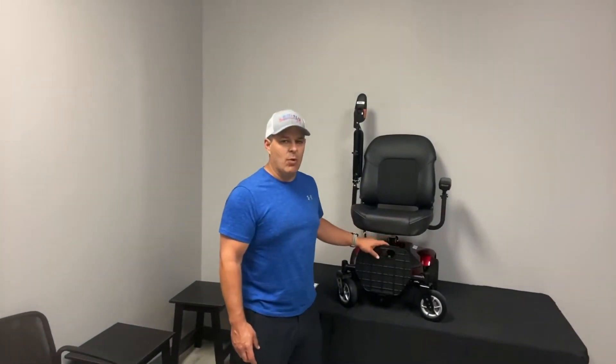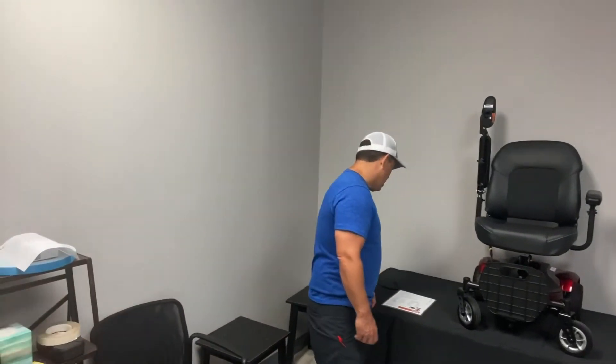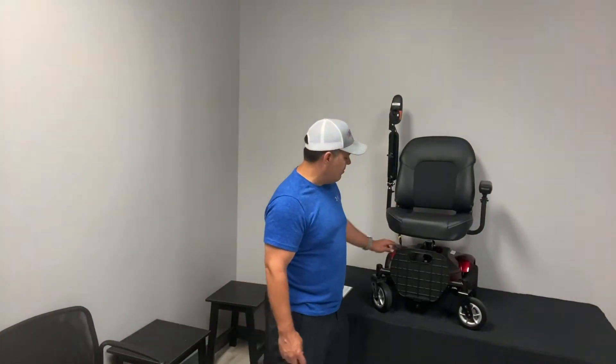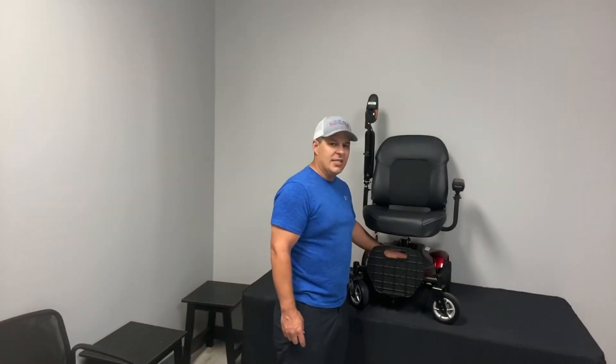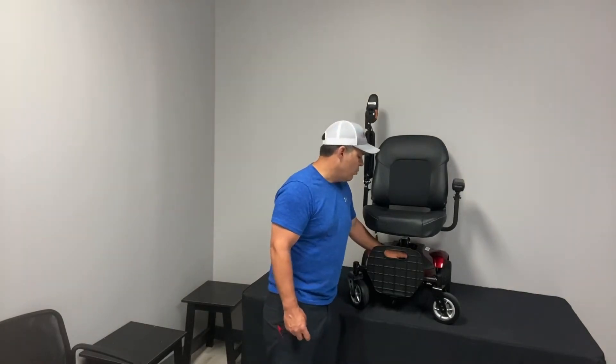I'm going to show you how it disassembles in just a second, but first I want to go over the batteries. The batteries are 12 volt, 14 amp, and there are two of them. They're in the front end of this device, which is your heaviest piece, and I'll go over that in just a second.